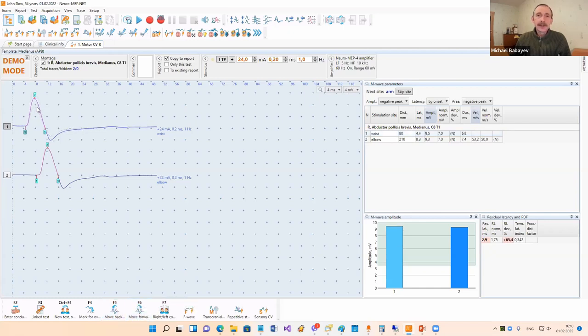I can select another trace here. After that, we need to input the conduction distance. Here you can see some default values in the test template, but in reality it's necessary to measure these distances and input real values. You can do it with a mouse click, but it's more convenient to use the device keyboard - press F2 and rotate a knob on the device to increase or decrease this value. If you want to change the marker position, it can be done with the mouse or the device keyboard. All parameters - amplitudes, latencies, and velocities - are calculated automatically.